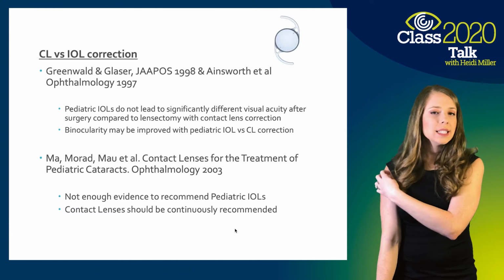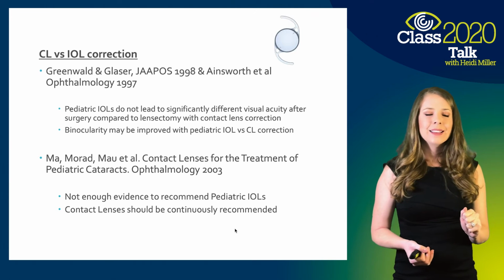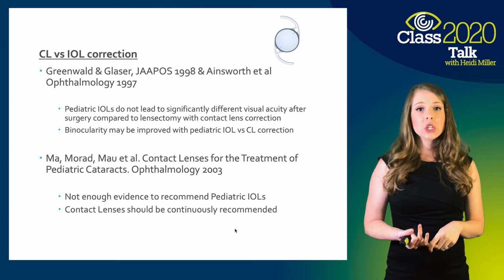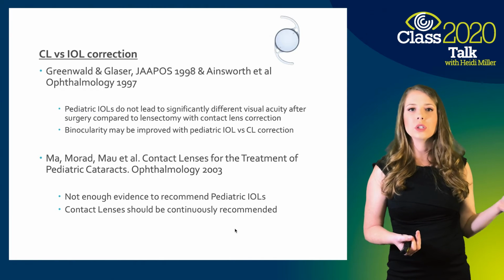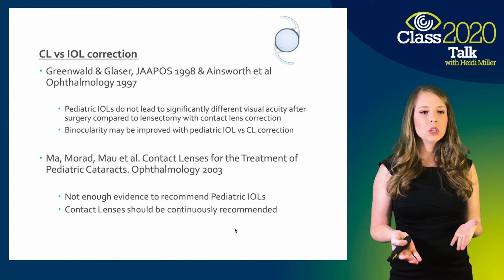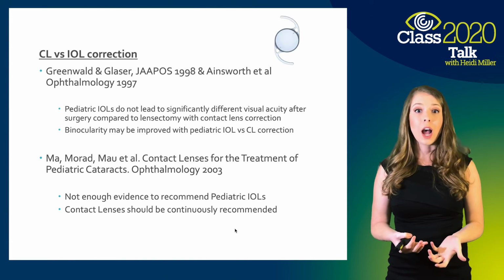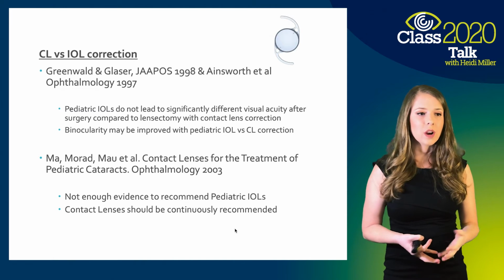When they looked at contact lenses in a study versus IOL correction, just to solidify this concept, pediatric IOLs did not show a significantly more improved visual acuity than contact lenses. So what this says is that contact lens correction is a very good option for patients for vision correction following cataract extraction.